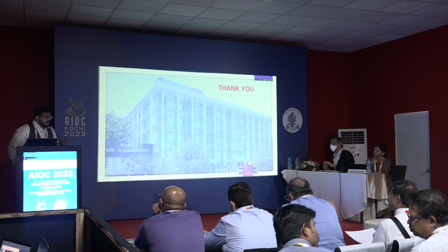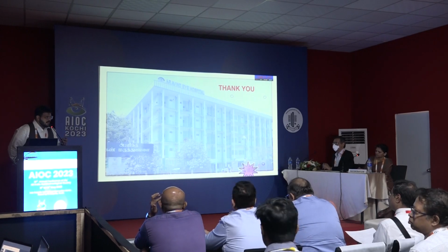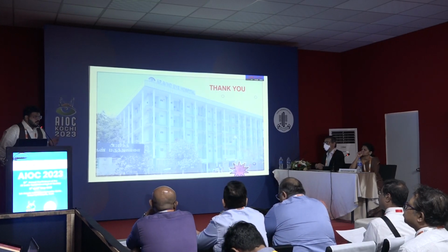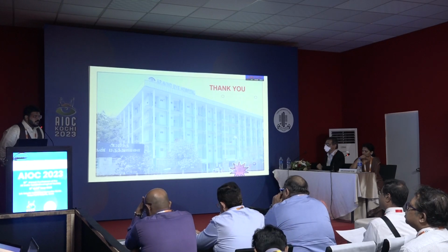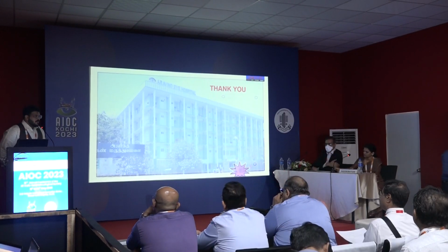We are trying to make a pig eye setup, in which our team from Netherlands did the same thing by cauterizing vessels of a cadaveric pig eye. So we are working on the porcine eye, and the study is going on. But before that, we want to make it into 23 and 25 gauge and then try it, because there's no point in experimenting with 20 gauge right now, because that era has passed by. But we are making good headway, and a lot of progress has been made.